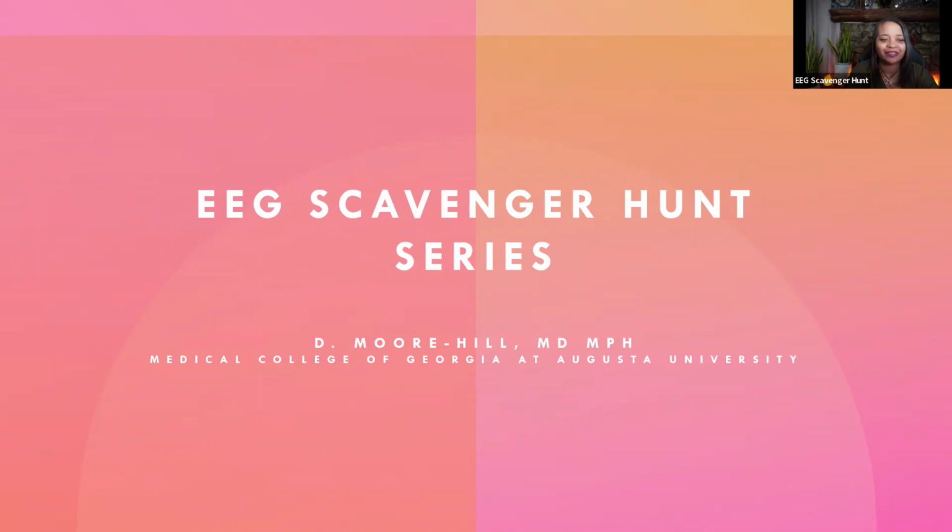I find that the first day on an EEG rotation for our residents is quite daunting, and I think some asynchronous content will help there as well, so you can start to review and start to feel comfortable in your own time and in your own space, and we'll help you along.